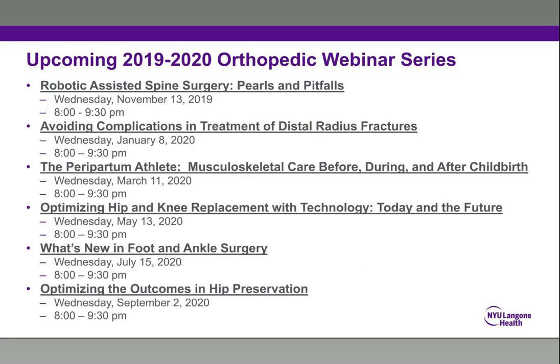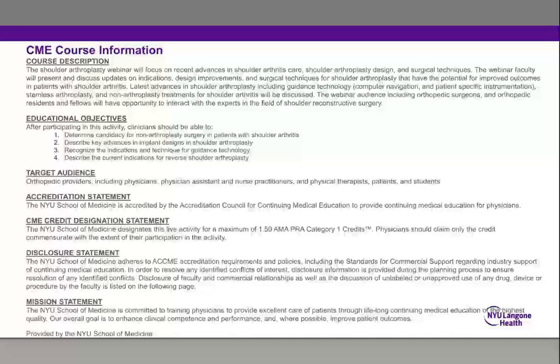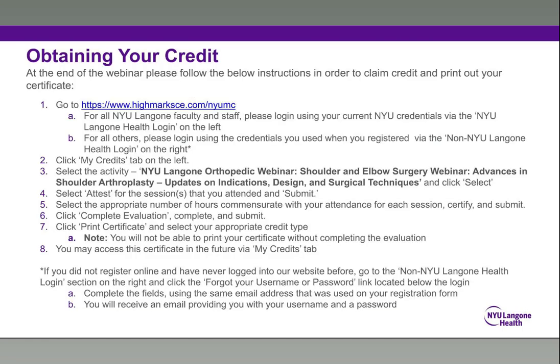Sorry. Yeah, so my approach is about the same as well. In younger patients where I'm worried about revisions, I tend to utilize a shorter or perhaps even a short no-stem implant, mainly because it is much easier to revise that prosthesis. But you cannot compromise fixation. So if there's not sufficient bone proximally, then you may have to go with a longer stem just to get better fixation on the humerus. I generally try to avoid using cement altogether. So if a short stem does not give me sufficient fixation, I'll just go to a longer stem to get fixation on the diaphysis.